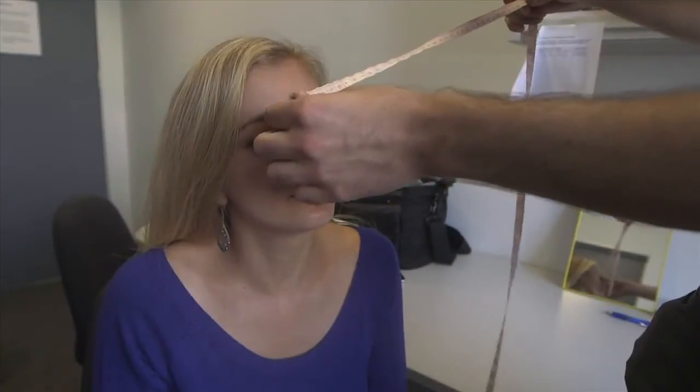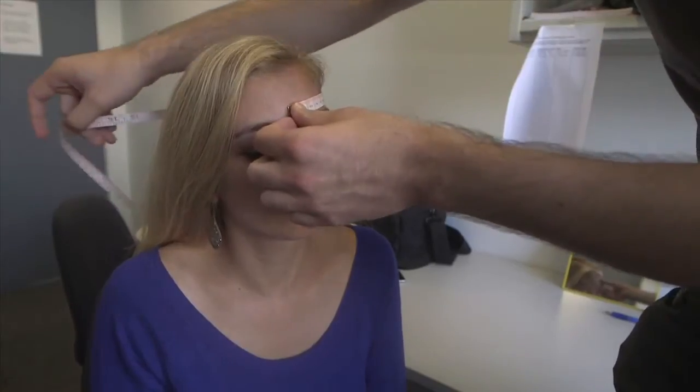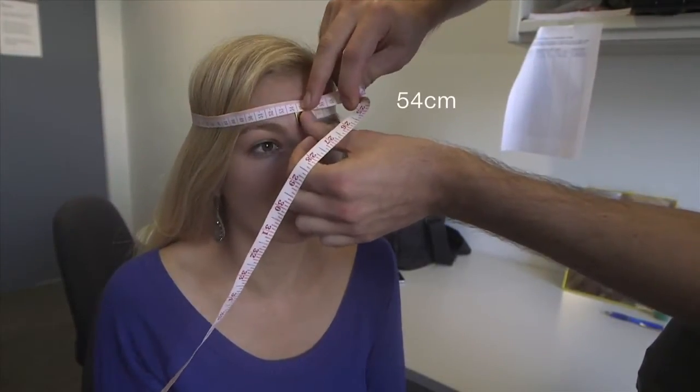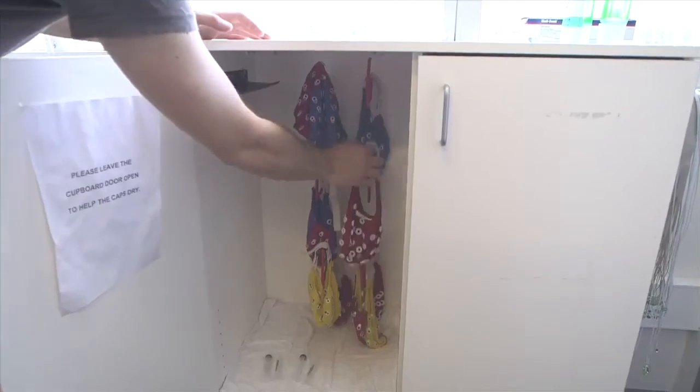The first step is to measure your participant's head. Start measuring from the center of the forehead and make sure you measure the part of the head with the wider circumference. This measurement will dictate what size cap the participant requires.